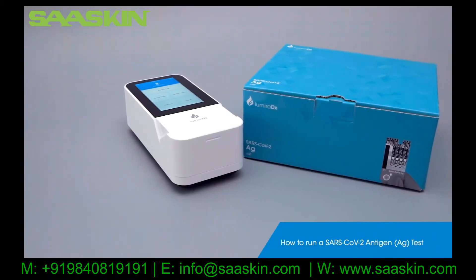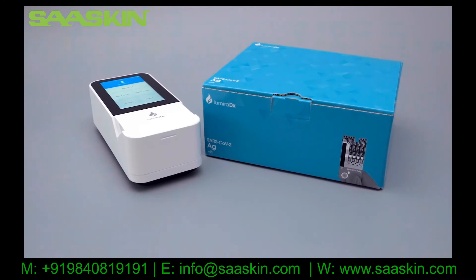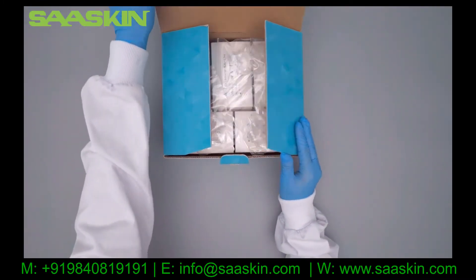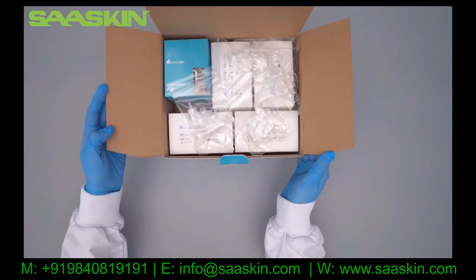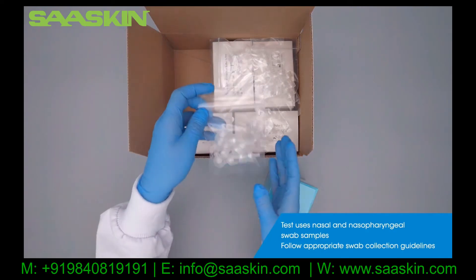This video will show you how to perform a SARS-CoV-2 antigen test on the Lumira DX platform. The test kit includes SARS-CoV-2 antigen test strips and extraction buffer vials. The test can be used with nasal and nasopharyngeal swab samples.